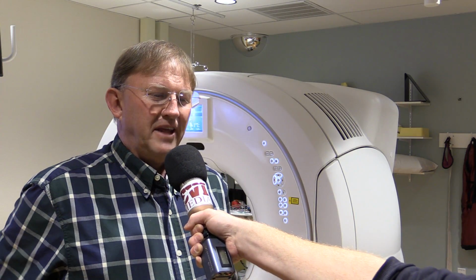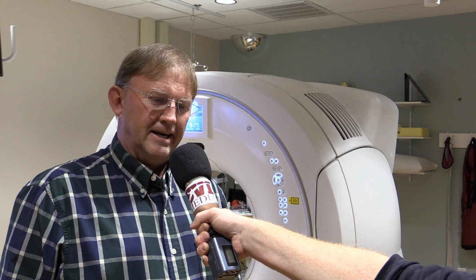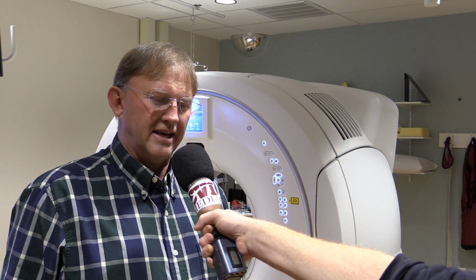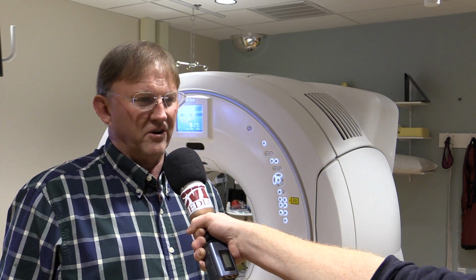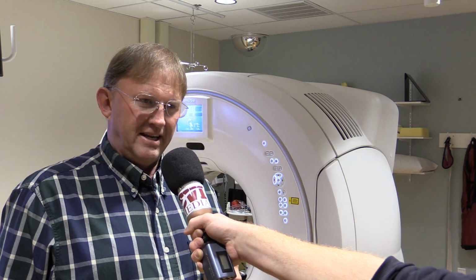So tell us what it's been doing for the past year, and then also tell us about some of the new things you're going to be able to start doing with it that you haven't been able to utilize yet. This scanner has done everything we've asked of it. When patients come through the emergency room, oftentimes after car wrecks, falls, things like that, CAT scan is one of the first things we do because it's a very fast way to get very high resolution images so the doctor knows exactly what to do, how that patient needs to be treated.